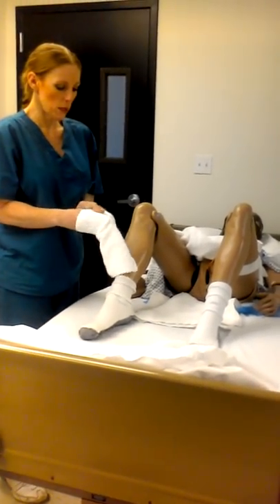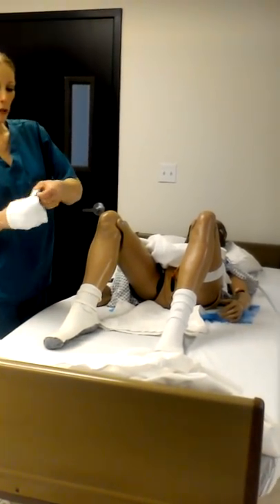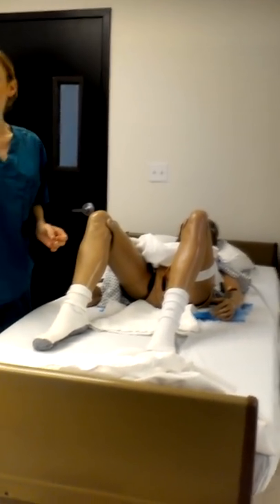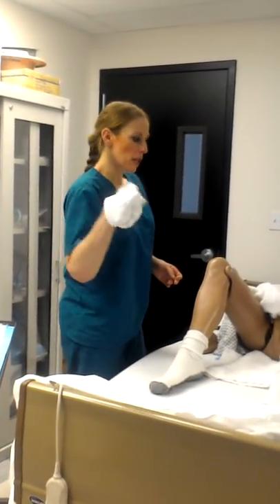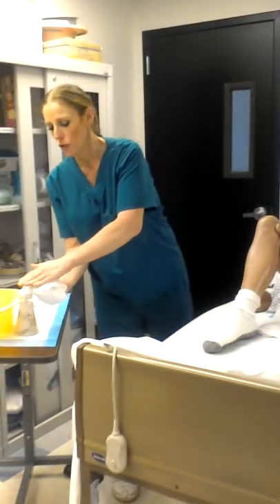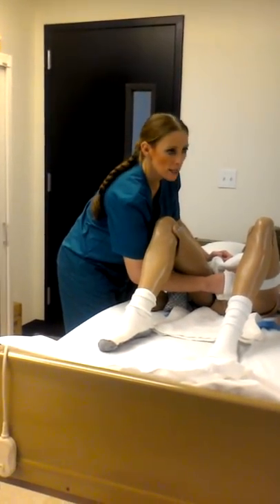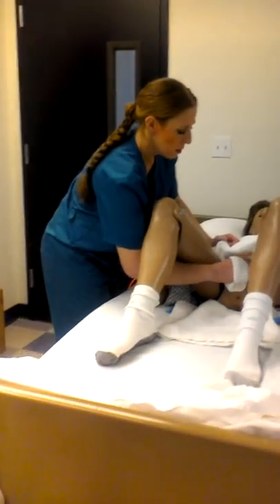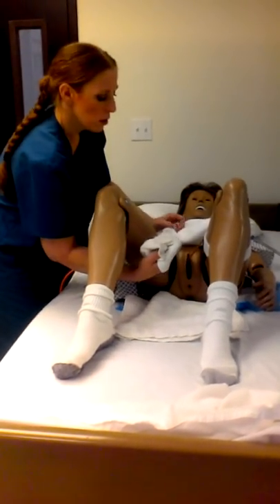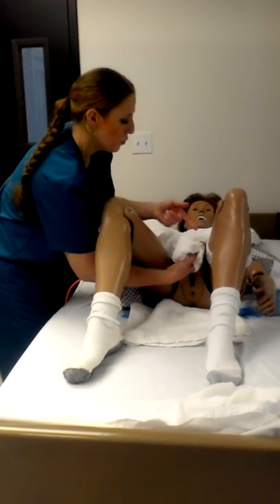Now you make the mitt opposite because you have to tuck it around your thumb like this so that you can clean around the catheter. You work under the thigh, edge of soap, rub it in. You go around the catheter and you open up these two fingers. You go down the catheter tubing.